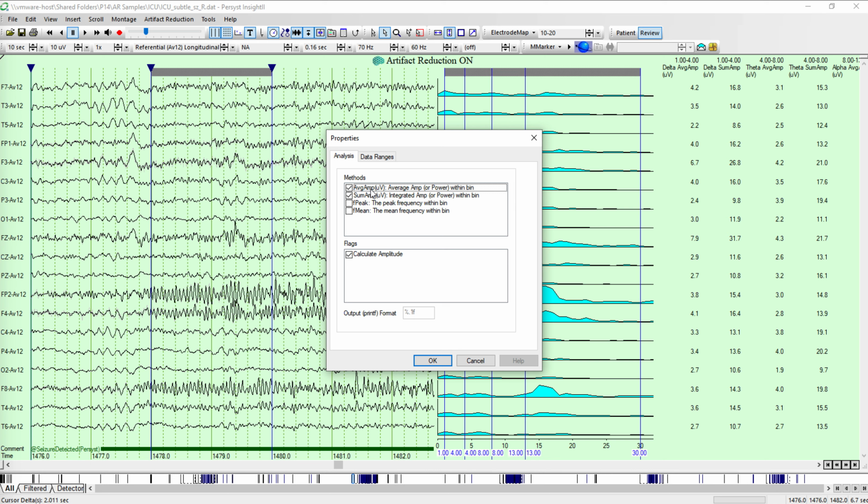We're calculating 0 to 1, 1 to 2, 2 to 3, and so on, up to half the sampling rate. And in the bins, we could take the amplitude of each one of those measurements. What's the EEG amplitude, for instance, from 8 to 9 hertz, measured in microvolts, 9 to 10 hertz, measured in microvolts.